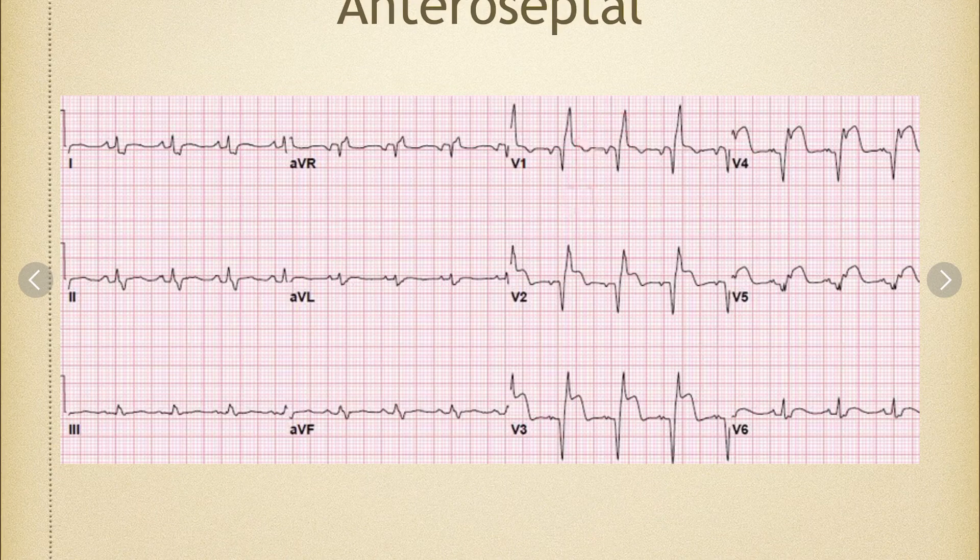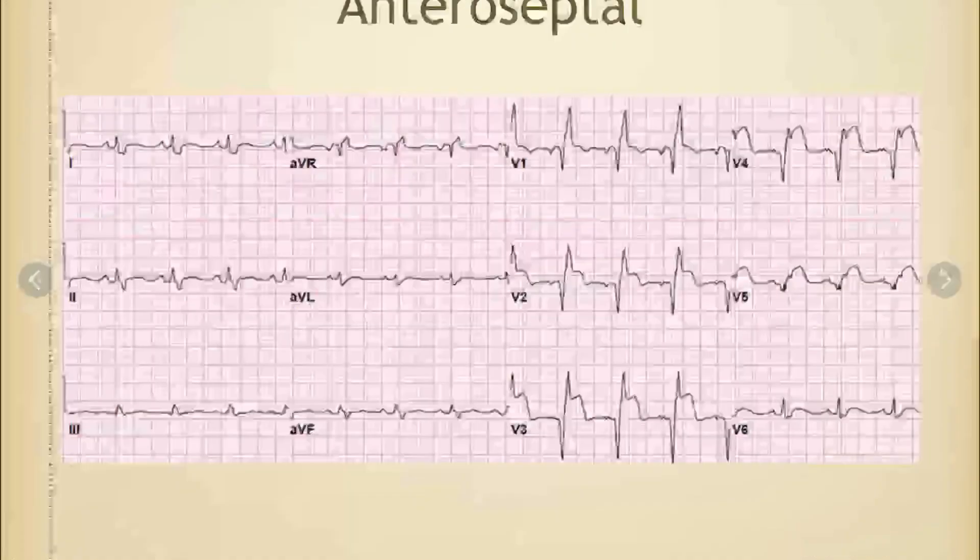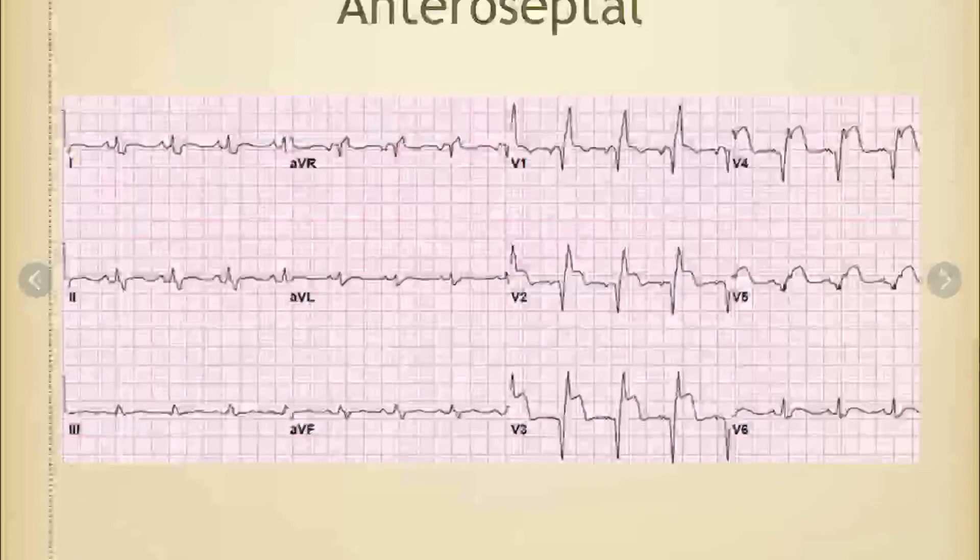So this really is over two areas. Remember this would be septal. And this would be anterior and this would actually be a little bit lateral. So this would be a good anterior MI that is spreading a little bit into the septal region and a little bit into the lateral.